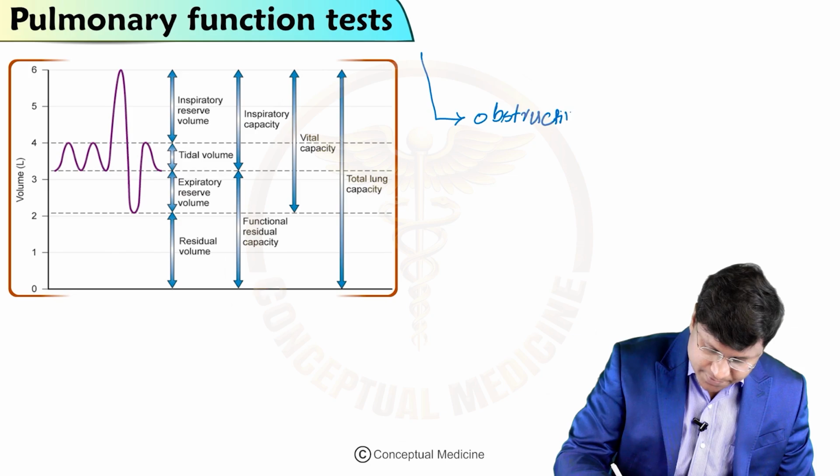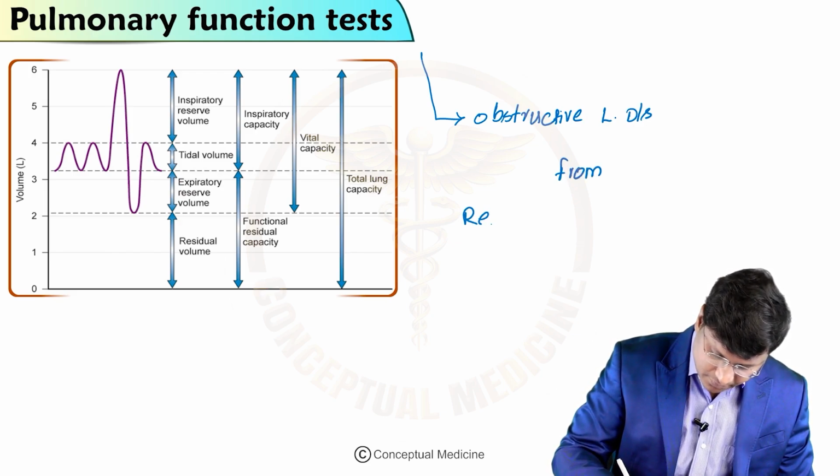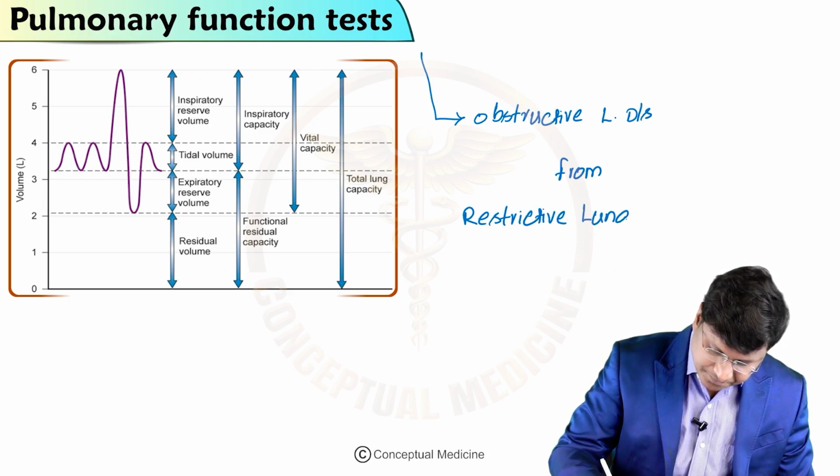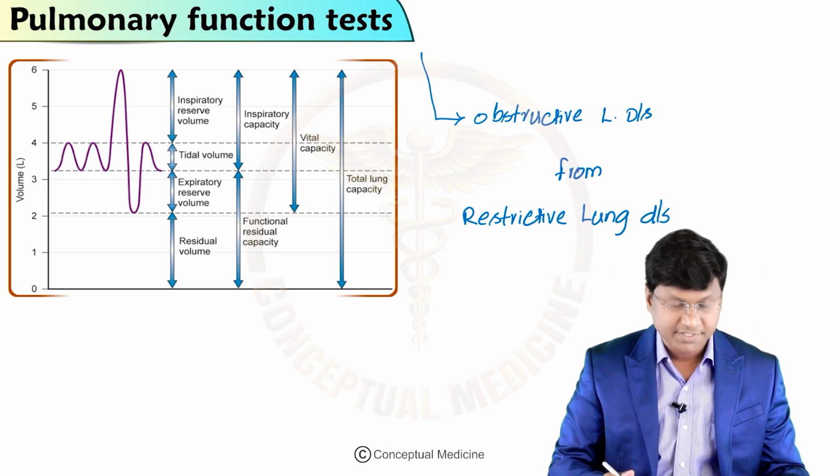Right, to differentiate obstructive lung diseases from restrictive lung diseases. So that is the main purpose of this pulmonary function test.